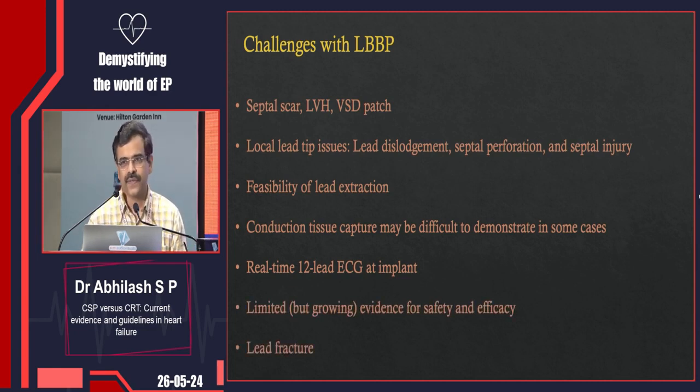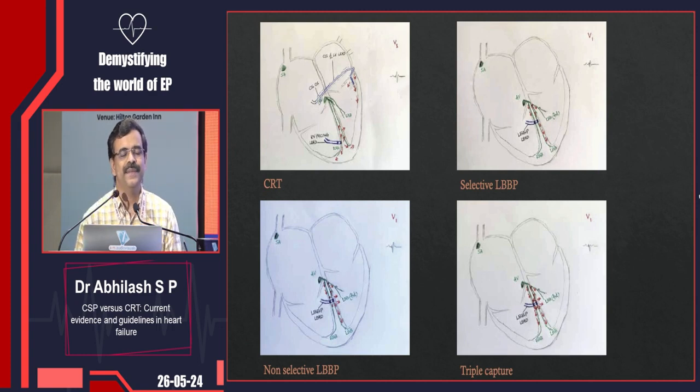And lead fracture, of course, we already have reports within our Kerala groups itself. But we want to see whether it is more than what is seen with conventional leads. Conventional leads are also not free of all these issues. But as in the previous discussions, we have other nuances. It's not just like Hero Honda, fill it, shut it, forget it. There is much more to the ECG during left bundle pacing.